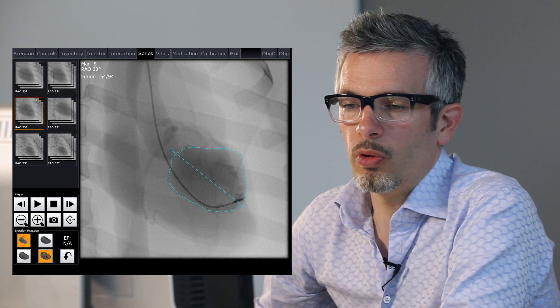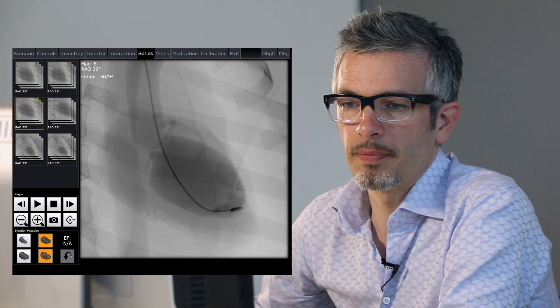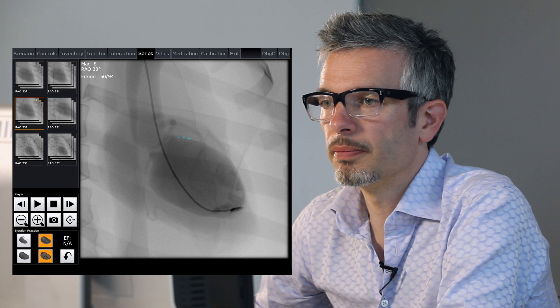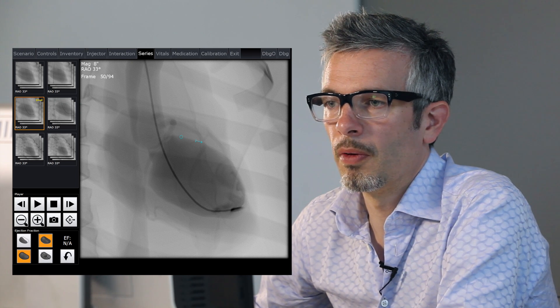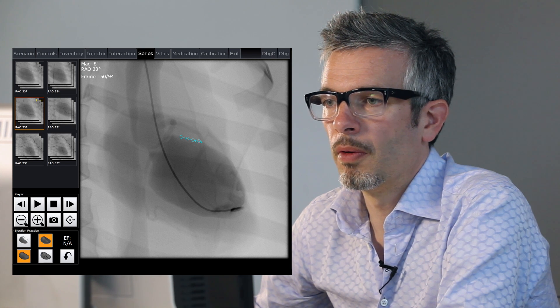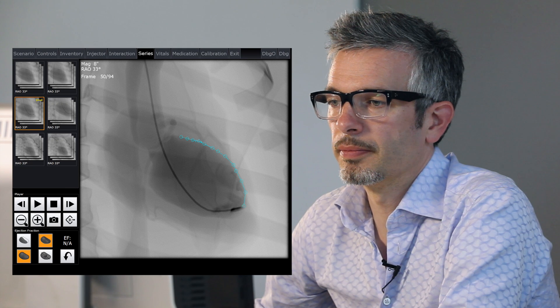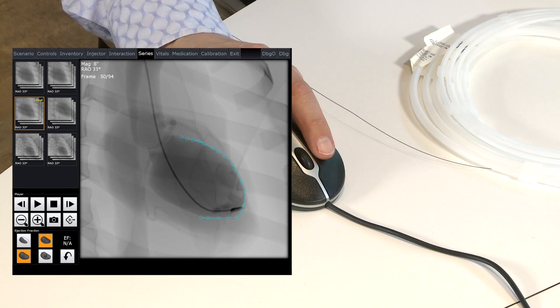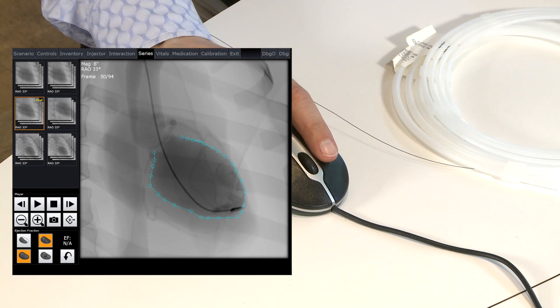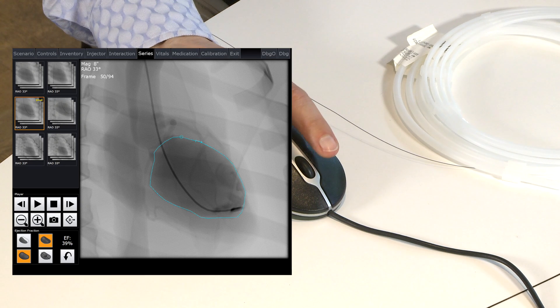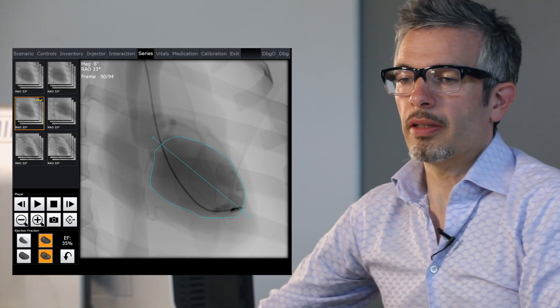We'll click on our rotational axis and draw the centre line through. Then we come on to do the same for our end-diastolic pictures. This is the frame which has the maximum size of the LV. We click around here again, going around the apex, over across the mitral valve, aortic valve, and then just close the loop. Draw across our rotational axis again, and that's it.